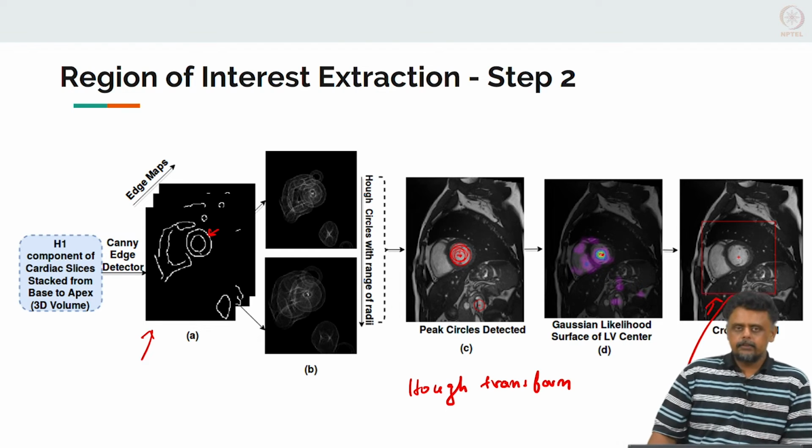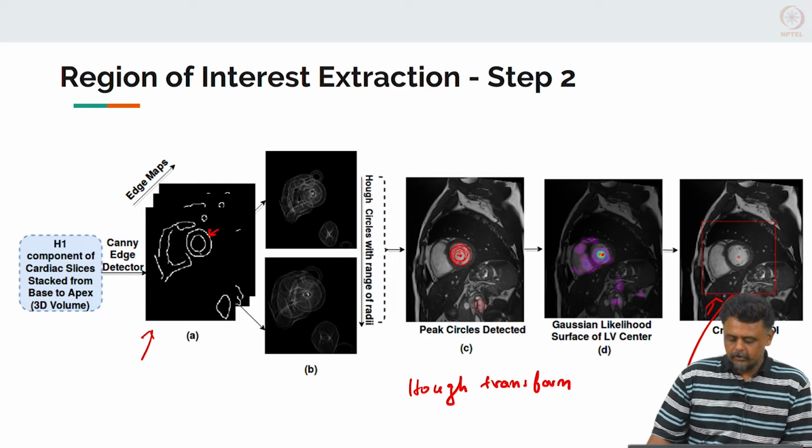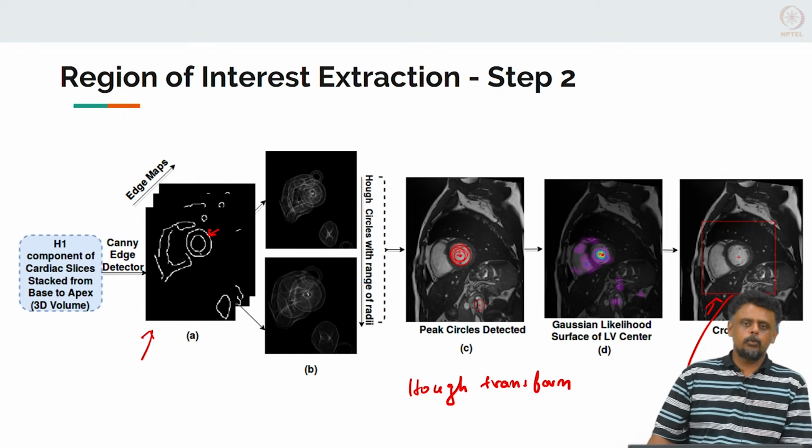The point I showed you this is also because, just because there are these deep learning tools available to you, that does not mean you can use them to solve every problem. Many of the conventional techniques that are out there are well studied, well documented and nicely programmed, and you can use them to actually make the problem much simpler.